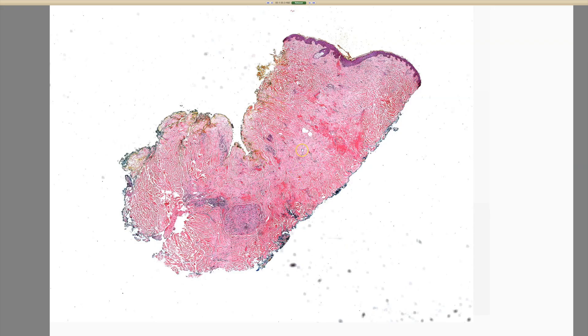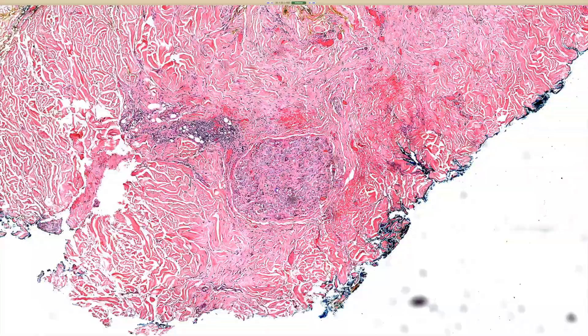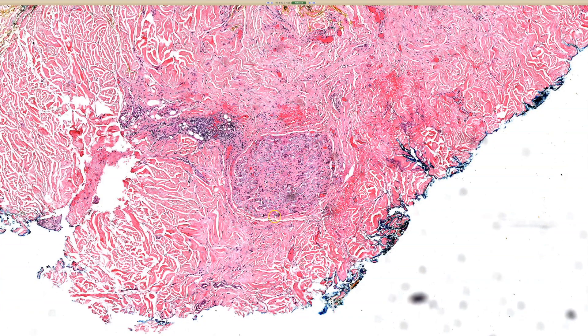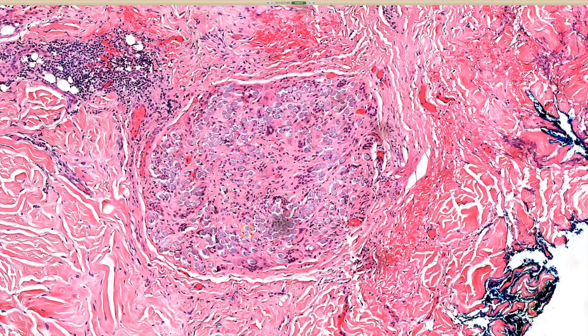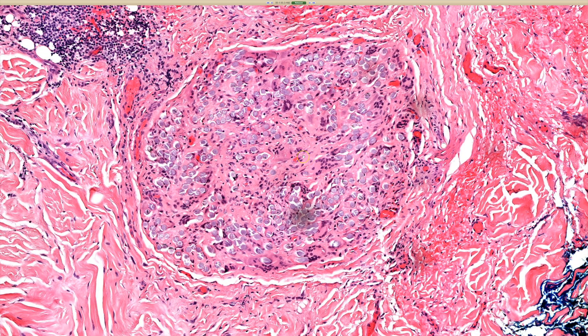Next case, case two. I can take this one, Dr. Gardner. So we see deeper in the dermis structure, and when we look closely, we see multiple filamentous structures in there with granulomatous reaction around it, a few giant cells.